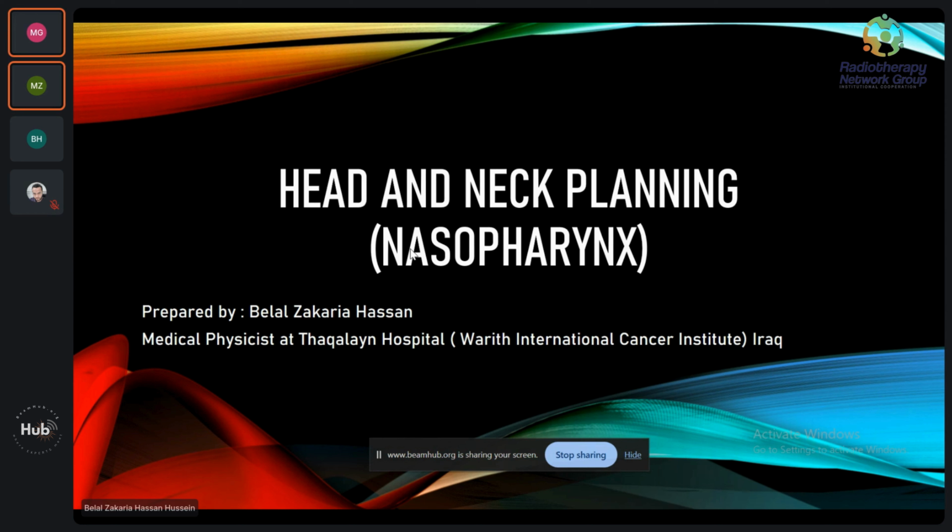And a lot of times, when we do the contouring, the automatic one in the planning system is not that accurate, and I have to repeat them, so repeating it would waste a lot of time for me instead of doing it from the start. You prefer to do it yourself. Yes, I prefer to do that actually. But some of my colleagues rely on the atlases that are in the planning systems right now. Okay.